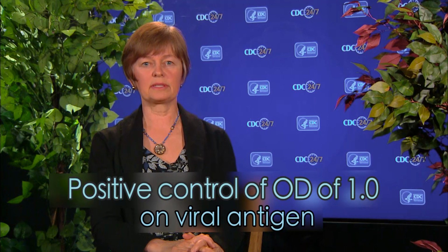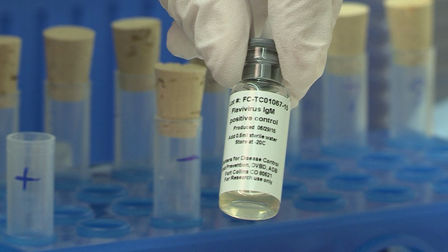Dilute the positive control according to a previous titration, where the resulting optical density should be around 1.0. This is to avoid wastage of positive control. In the test shown here, we are using the flavivirus group-reactive chimeric humanized monoclonal antibody 6B6C1, diluted at 1 to 3,000 in wash buffer.